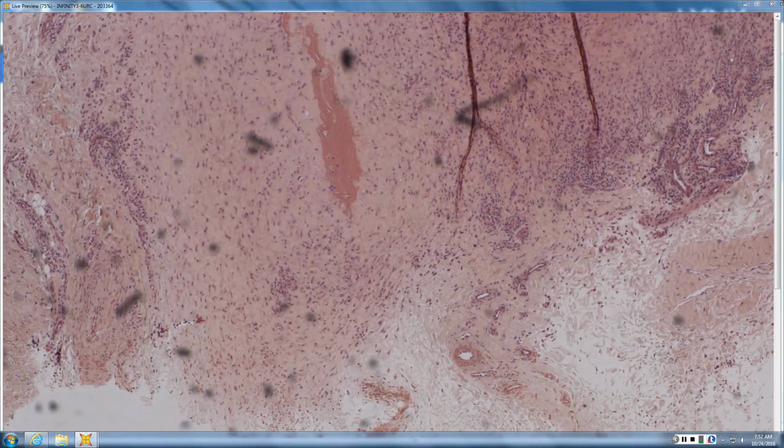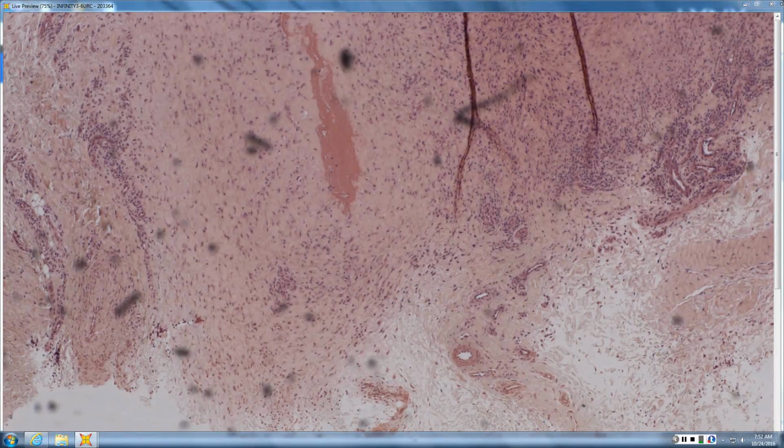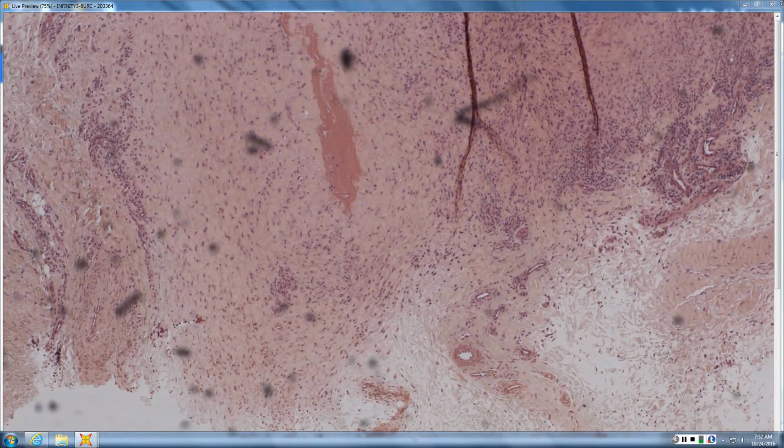So when you look at a vasculitis, if it's early, there's a lot of blue because the fibrinogen hasn't polymerized yet. In late vasculitis, it's red because it's all turned to fibrin. And in rheumatoid nodules, it's red because it's very chronic. It's all polymerized fibrin, not blue fibrinogen that just leaked out of a vessel.